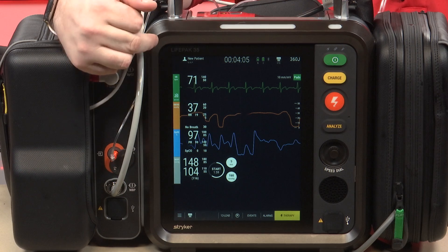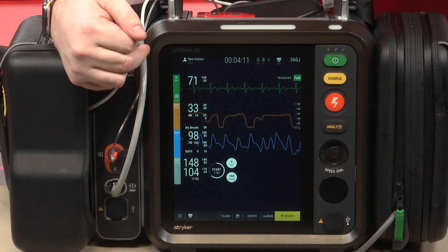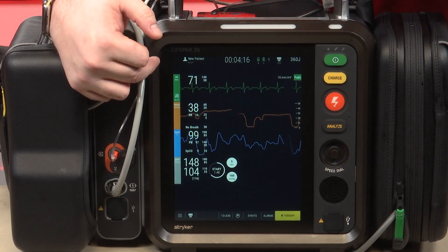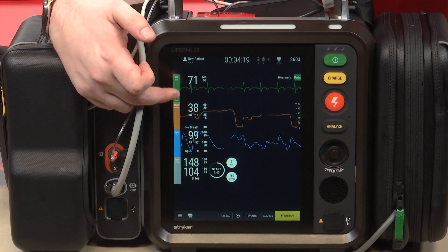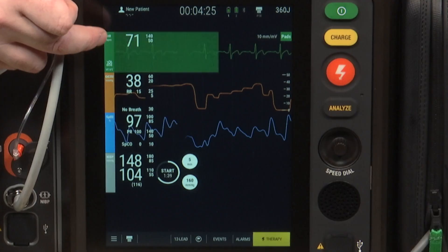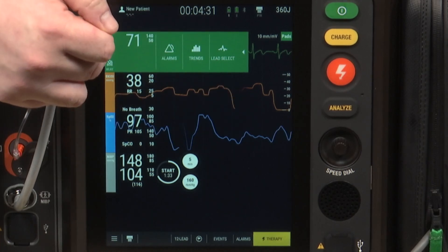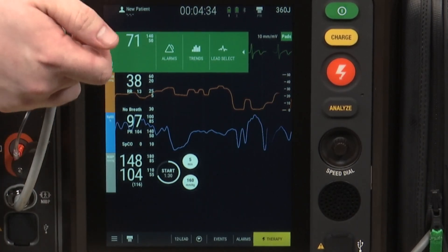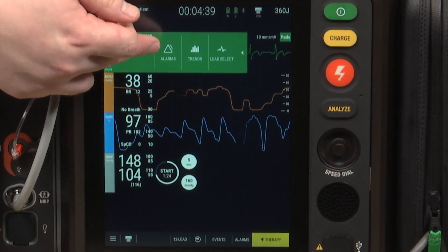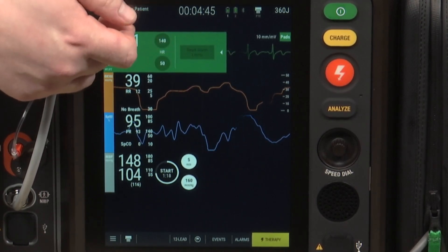The first feature here applies mainly to ALS clinicians, but it's helpful for BLS clinicians to know in case they need to change something. There are options for each parameter that you can access by clicking on the color next to it. If I click on the green next to the pulse, I have buttons for alarm, trends, and lead select. For all the other parameters it will look the same except there's no lead select. If I click on alarms, that gives me the alarm options I can turn on and off, which are different for each parameter.